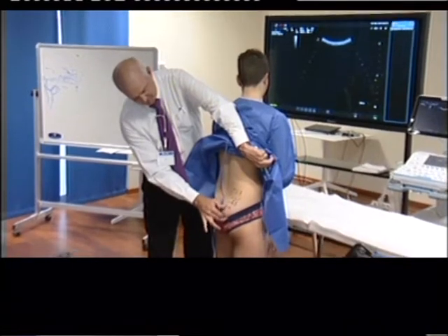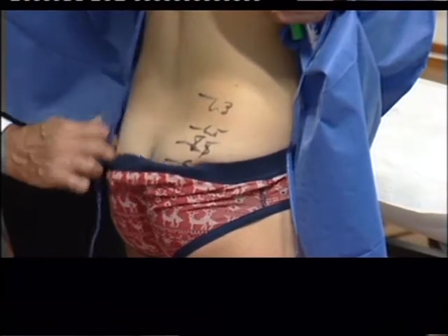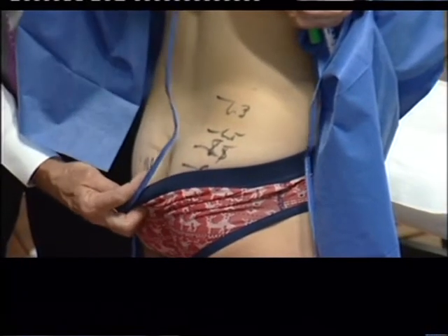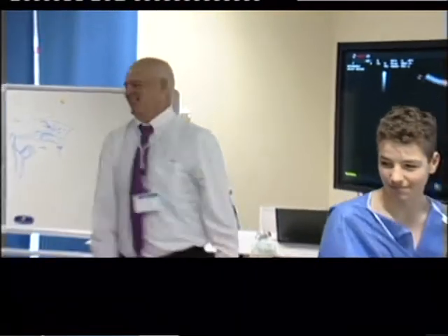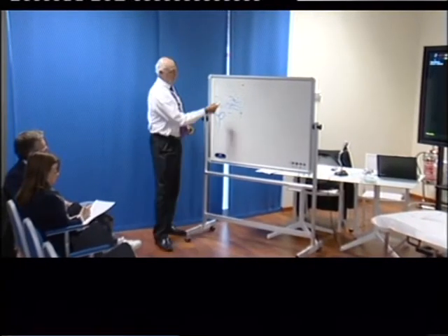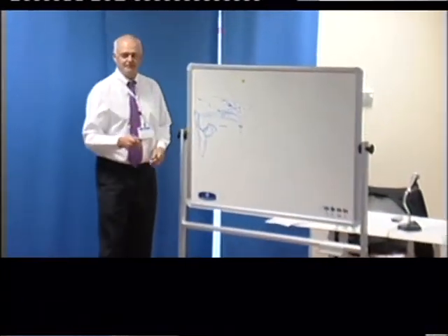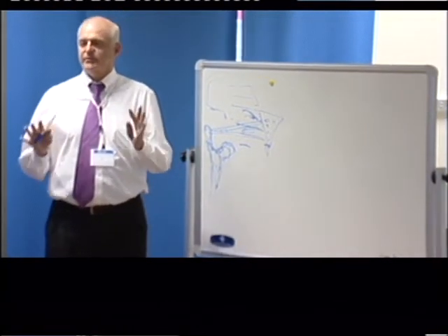So caudal, sacral, SI, L5, L3, and then we have lamina, facet, nerve root, transverse process. Okay. So we need to pivot down to find the piriformis. So here's the important thing about doing the posterior hip.